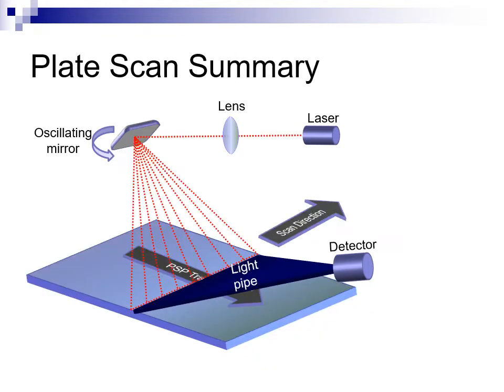The illustration below is a summary of the scanning process. The plate moves through the scanner while the laser scans perpendicular to the plate's motion. The laser projects a small dot onto the PSP plate the size of the pixel. So by changing the size of the laser dot, the size of the pixel will change also. It should come as no surprise that smaller cassettes may be scanned at higher resolution than large cassettes. Imaging of small body parts often requires a higher level of detail for proper diagnosis.